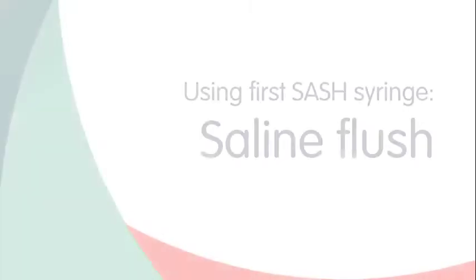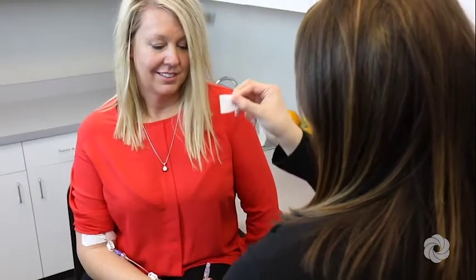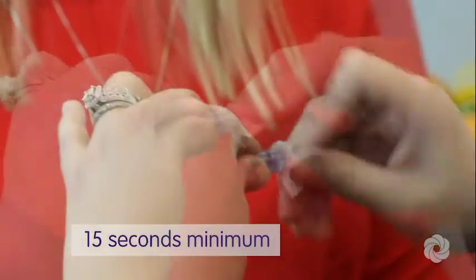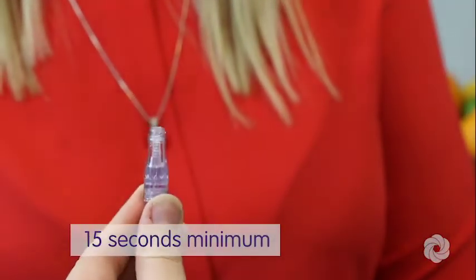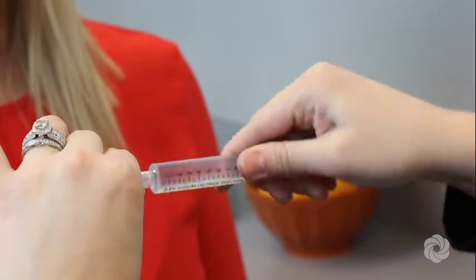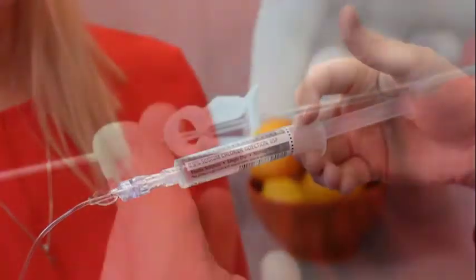You are now ready to flush your IV line with saline. Scrub the needleless connector on your IV catheter with an alcohol wipe for at least 15 seconds and allow to air dry. Remove the protective cap from the saline flush syringe. Attach the saline flush syringe to the needleless connector using a push and clockwise twisting motion until secured together.